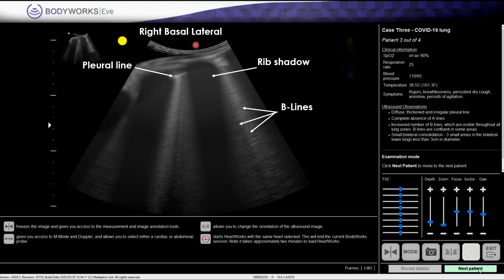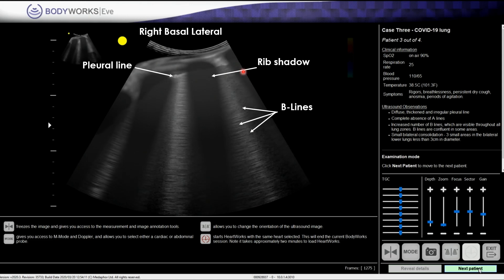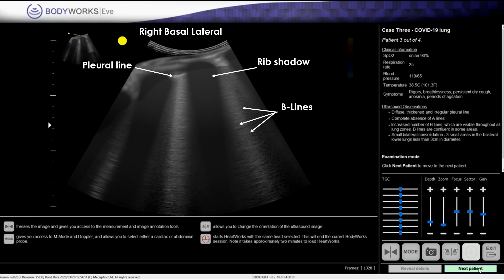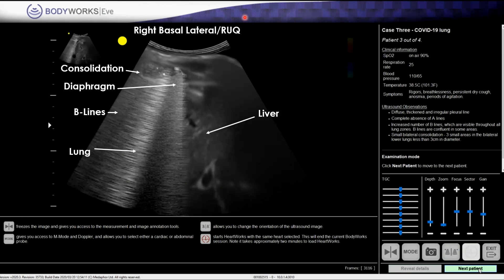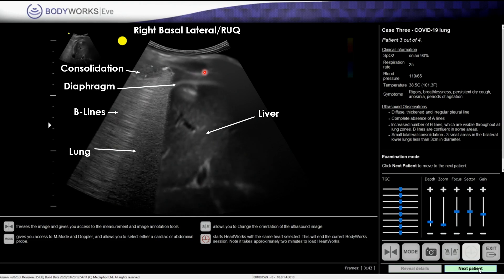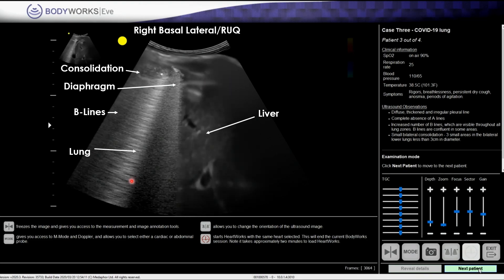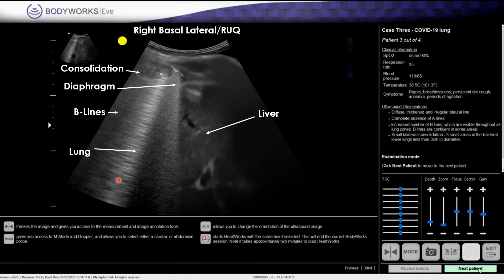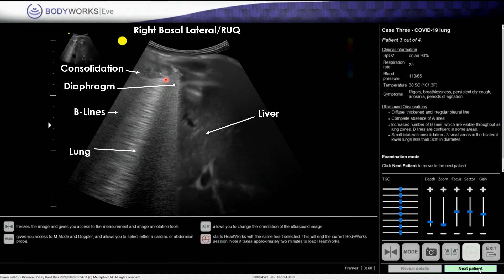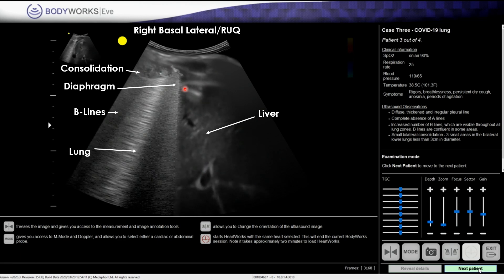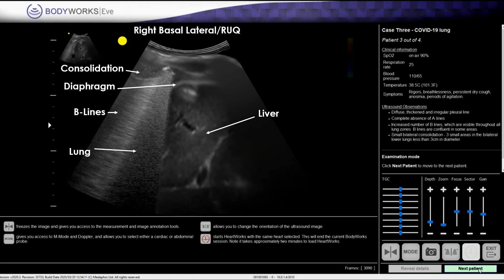In the same patient's right basal lateral scan, you see the pleural line with rich rib shadowing and a lot more B-lines — bilateral, not just unilateral. In the right upper quadrant view, with the liver visible, you see a lot of B-lines so confluent you can barely see the diaphragm, with a consolidation of about two and a half centimeters measuring caudal to cephalad. This combination of thickened pleural line, consolidations, and no effusion makes you very suspicious for COVID-19.